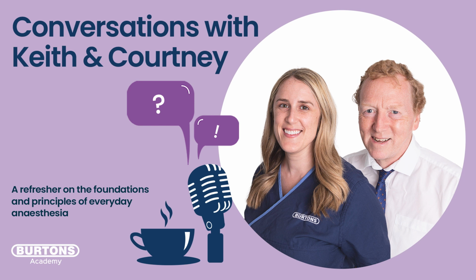So what happens if it wanders? What happens if the compliance is different from what we thought, so that our delivered volume, if we're pressure cycling, is different from what we thought it was going to be? And what happens if we haven't selected a sufficient tidal volume when we're volume cycling? The net effect is that every breath is less in volume than we expected, or wanted, or what the patient requires, or the respiratory rate is less.